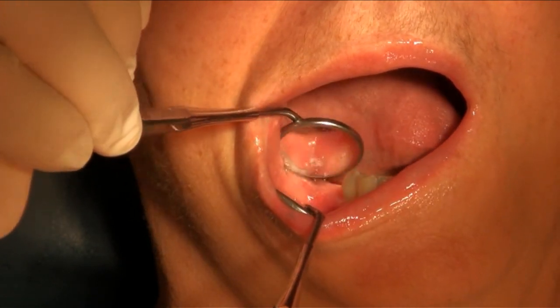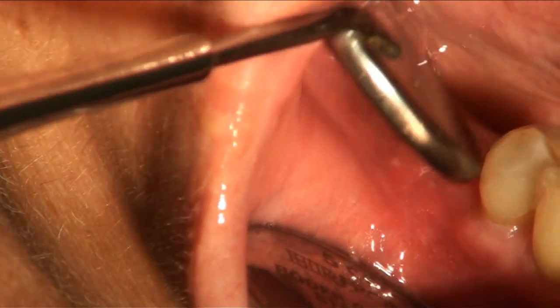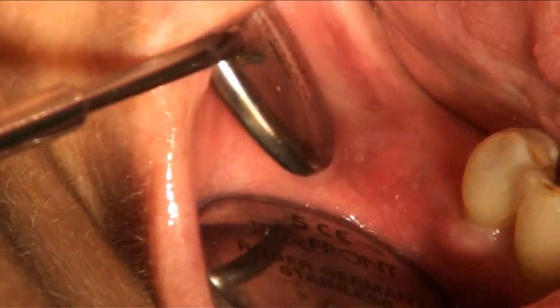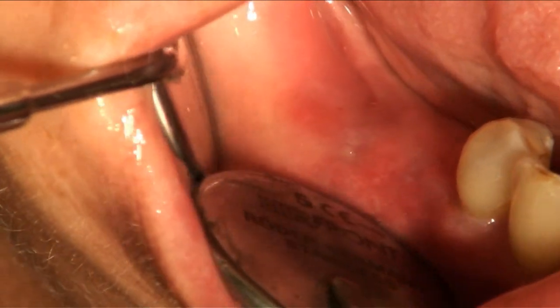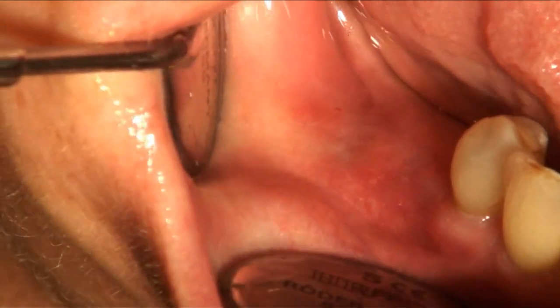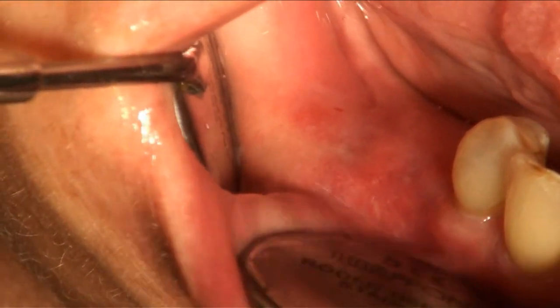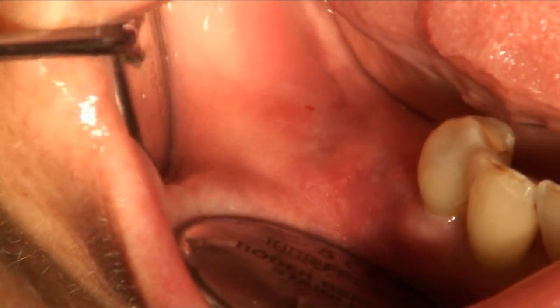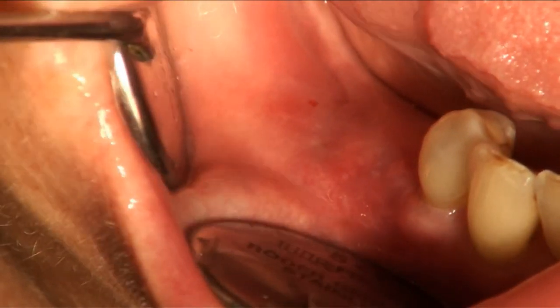So we see the situation of the extended mucosa in this area, and underneath there is the expander, which will be extracted parallel to the soft tissue flap reflection and the preparation of the site.